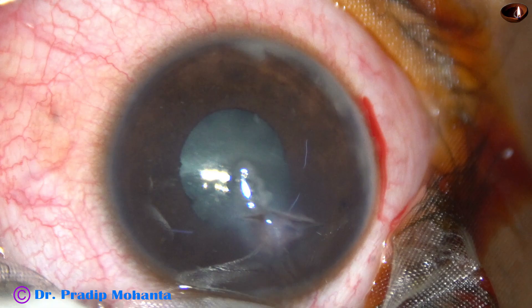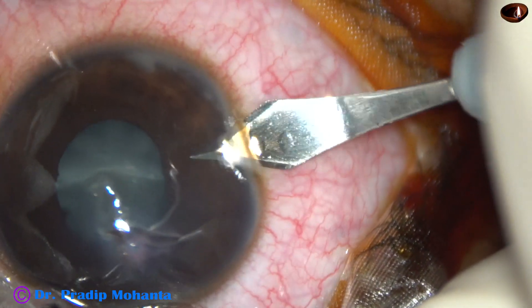Friends, welcome. This is a case of corneal tear with traumatic cataract. Let us observe this surgery.